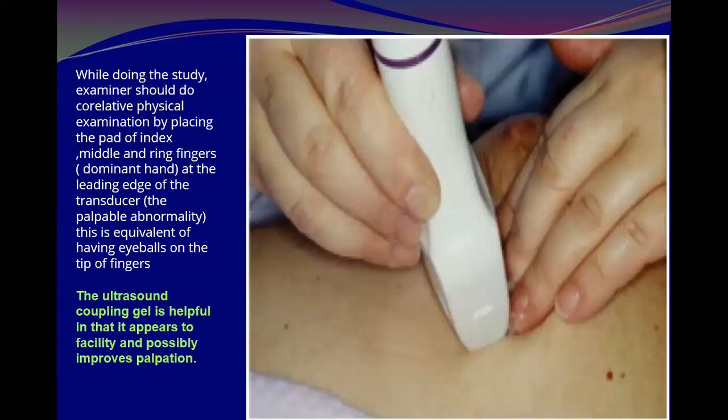Regarding palpable abnormality, this is essential. We said if the patient has a palpable abnormality, she has to put her finger, and you have to put your finger on the palpable abnormality, then scan it.